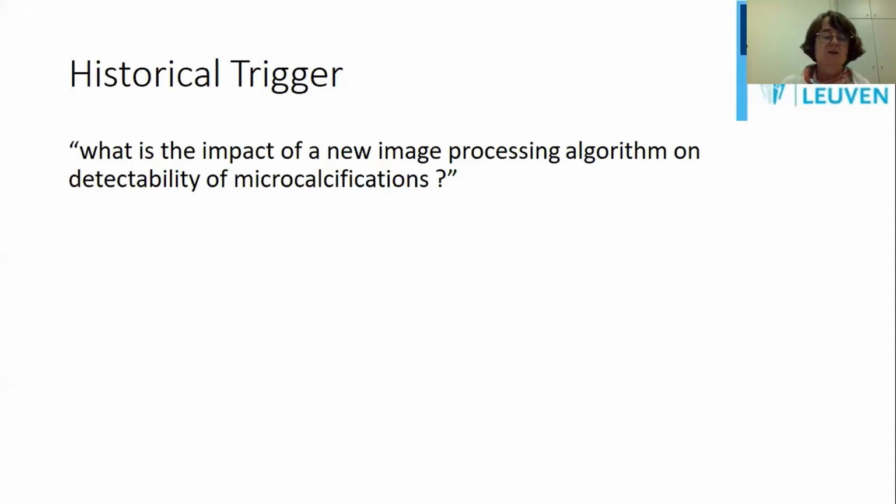And we were asking ourselves what would be the impact of a new image processing algorithm on breast imaging, and even more specifically on detectability of microcalcifications, because early on we had understood that detectability of microcalcs is probably going to be a most critical part of the job. And there you are. How could you possibly test the impact of a new processing algorithm?